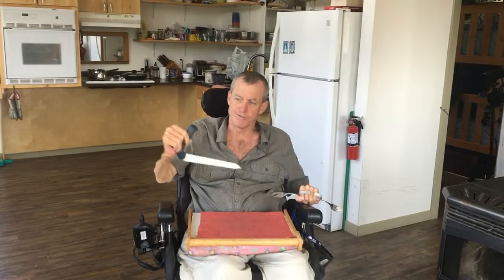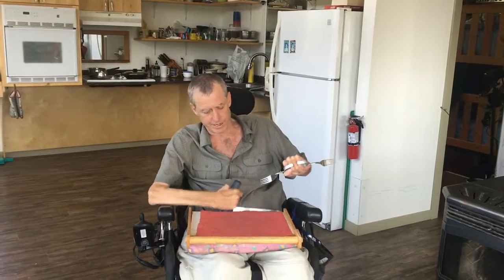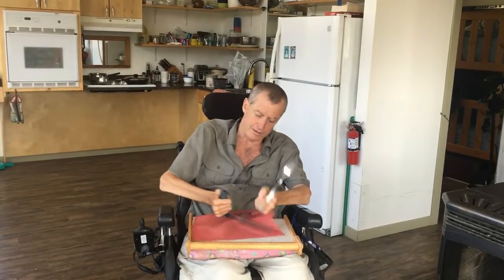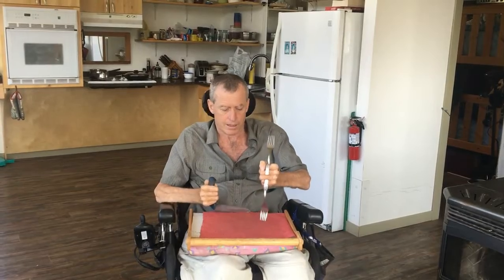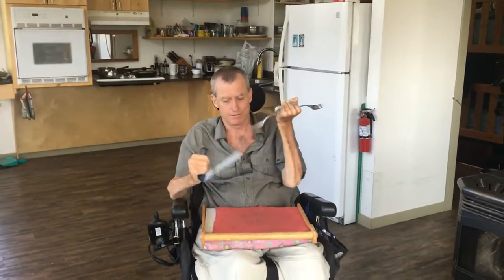And I like to use these knives. They're commercially available. It's just an L-shaped thing. You can get them several different places. But they slide over my hand pretty nice. So if I want to cut something, I can just go jab in like that and cut. This is serrated, by the way. It's easier to use. And then I can go like this and eat.